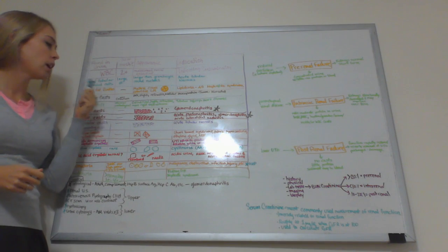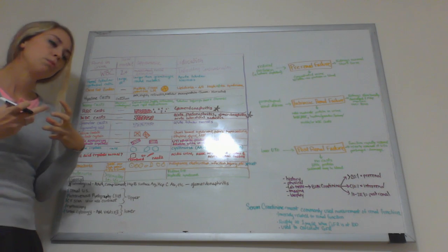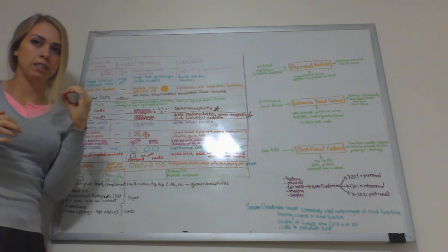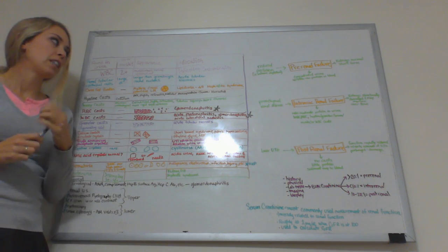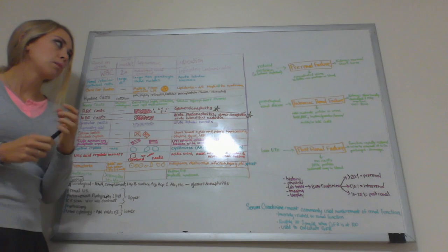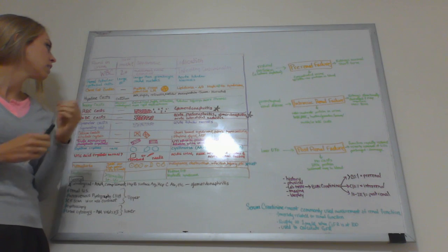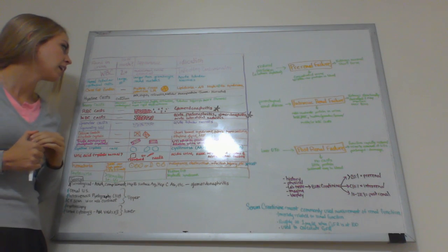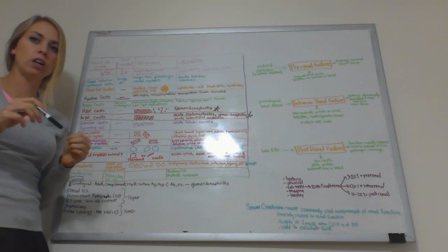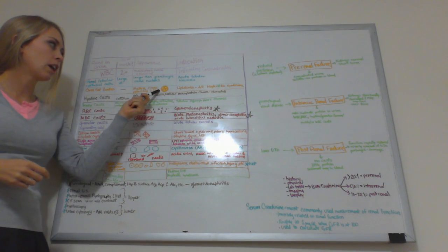So these renal tubular epithelial cells, if they become laden with lipids in the tubes and they come out, like if you have lipiduria due to nephrotic syndrome, then you can get these epithelial cells that are called fat bodies because they're full of lipids. And we talked about that with nephrotic syndrome. So these cells are known as the fat body cells, or oval fat bodies. They'll have that Maltese cross look when you look at them under polarized light microscopy. And we talked about that already, but here's what they would look like.